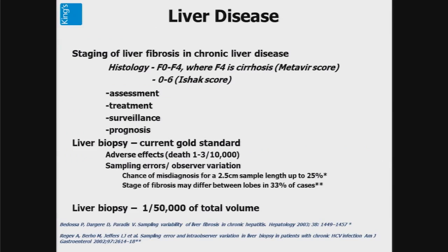So what are you looking for? Well, you're looking to assess, to treat, survey, and prognosticate for the patient based on your ultrasound findings. Why don't you want to do a liver biopsy?